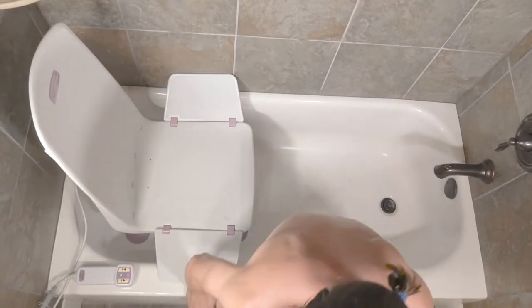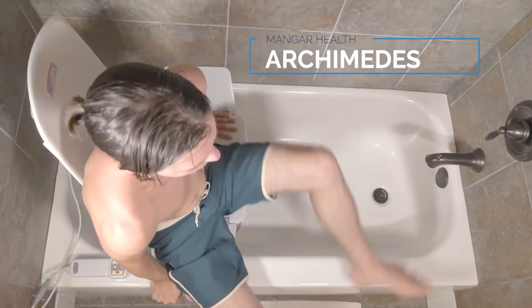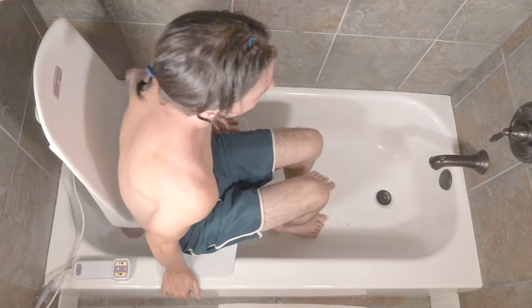If you don't plan on taking it out of the tub very often, need additional back support, or just want something more affordable, Mangar's Archimedes bath lift might make a bit more sense.